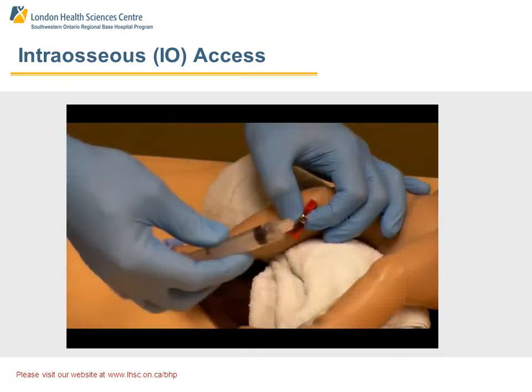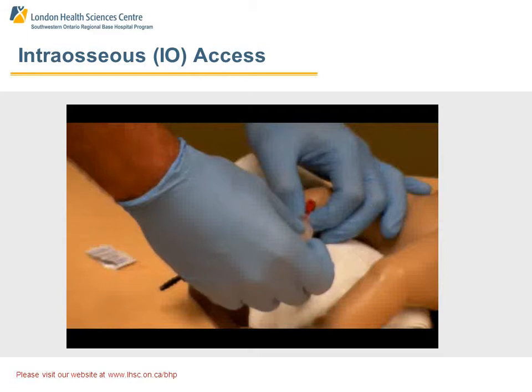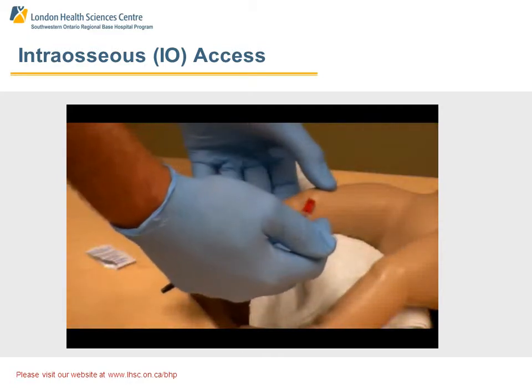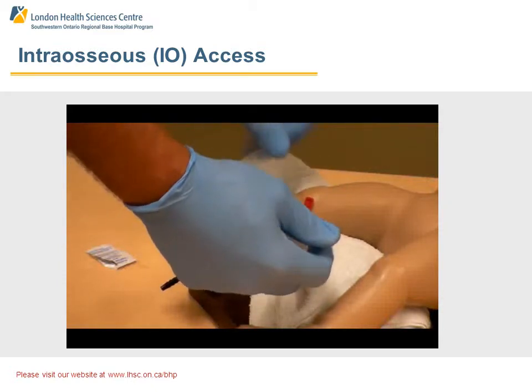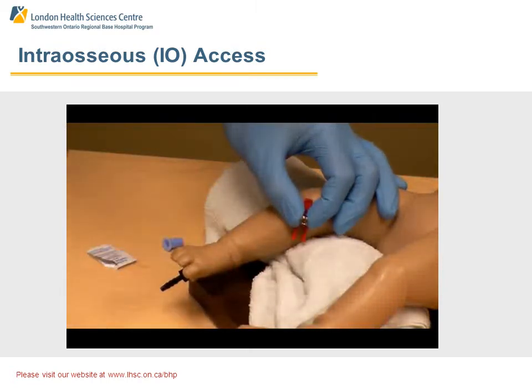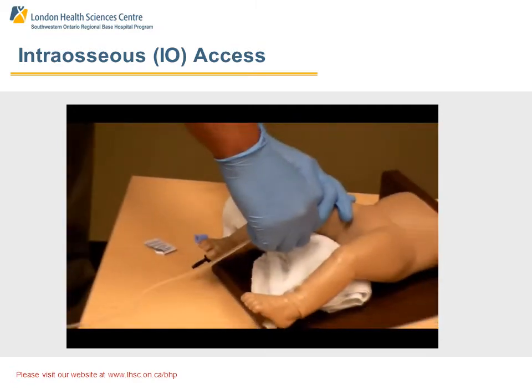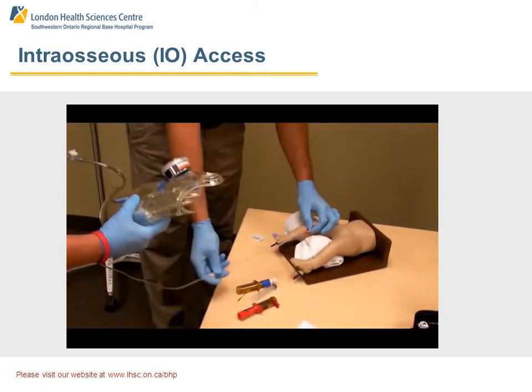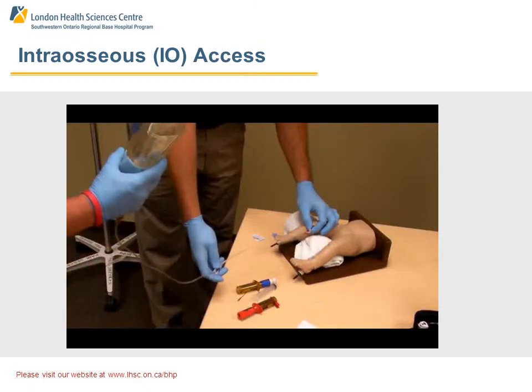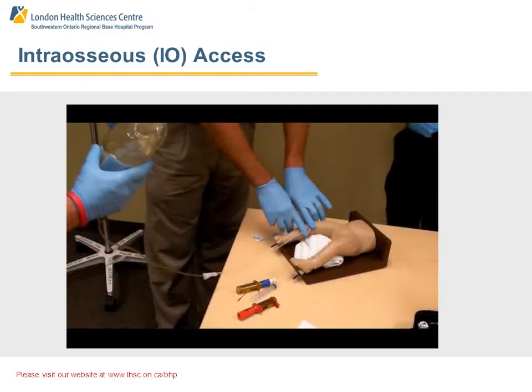Take the red firing pin and use it to secure the needle. With a twisting motion, remove the trocar. Take a 10 cc syringe with 5 cc's of fluid, attach it, pull back to get marrow, then push the fluid in to ensure it's in the proper location. Attach the IV line and run fluid with up to 300 mmHg of pressure behind it. Secure the red firing pin with two pieces of tape, one on each side. That is the big gun.